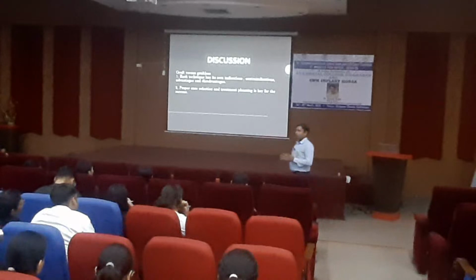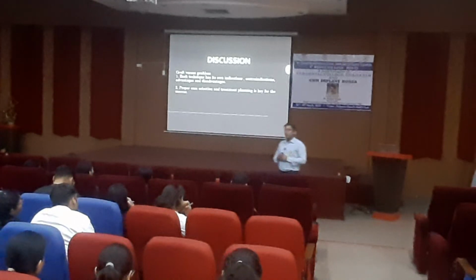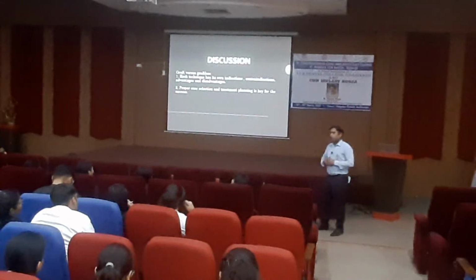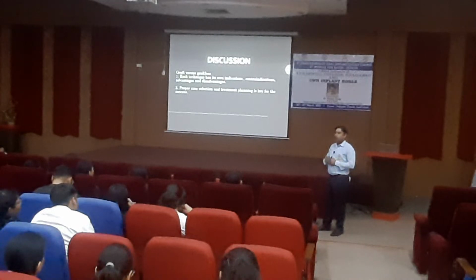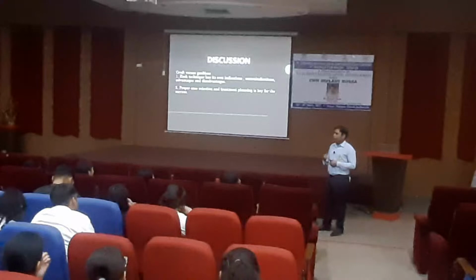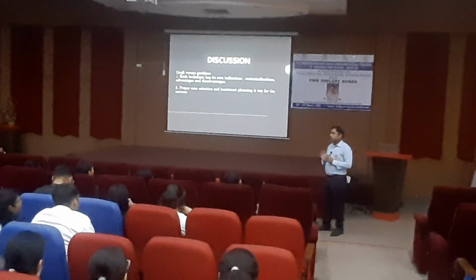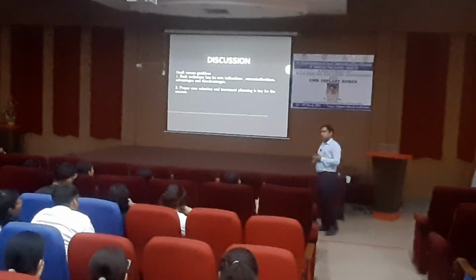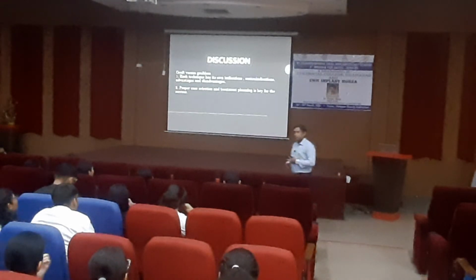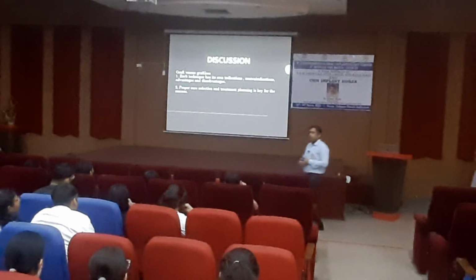And straighter implant is always better as compared to the tilted implant, because the forces are more going into the one side of the implant. The more forces are concentrated and more chances of failure. If it is a straight implant, all the forces are going in the long axis of the implant and it is dispersed. So less marginal bone loss you have to see in cases of straighter implant as compared to the tilted. ठीक है, fine. Any question?